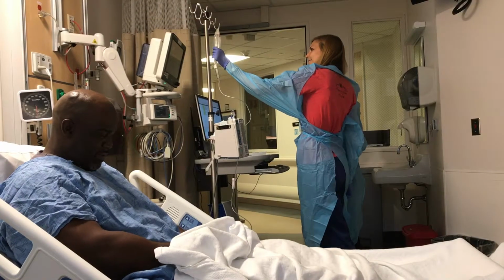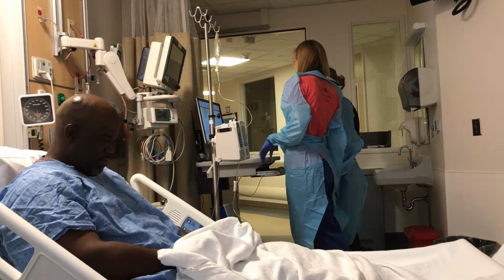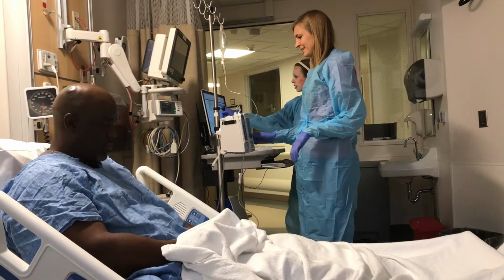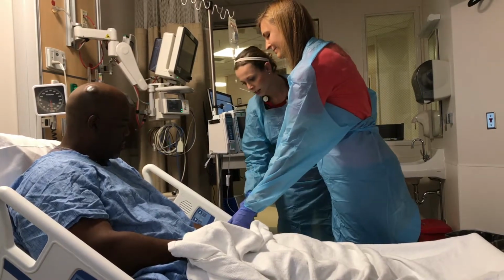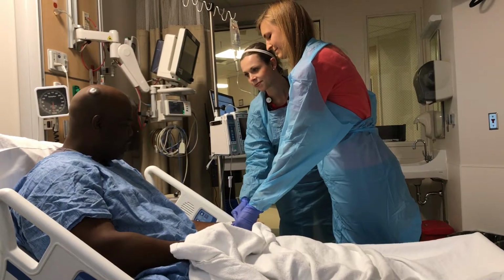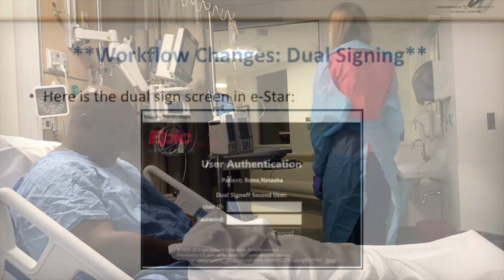We've got heparin, and it's going to go at 2,000 units an hour with no bolus. Okay, good. See that? And then you can see his name and birthday. Can you tell me your name and date of birth? It's Mr. Holiday. Date of birth is 1/1/2000. Perfect. Thank you, Mr. Holiday.